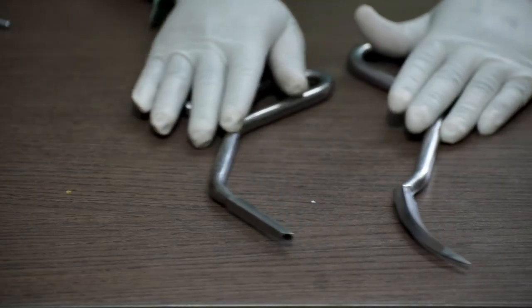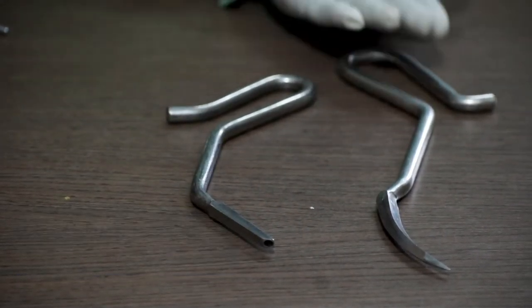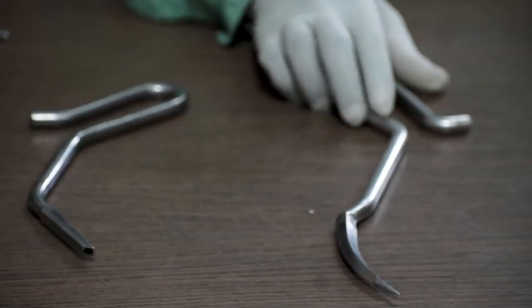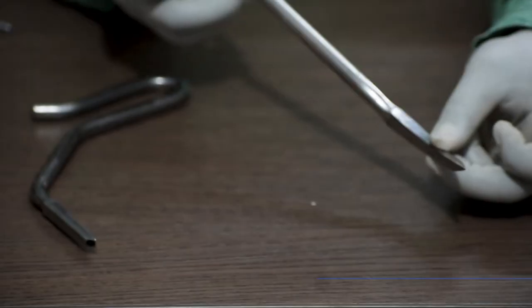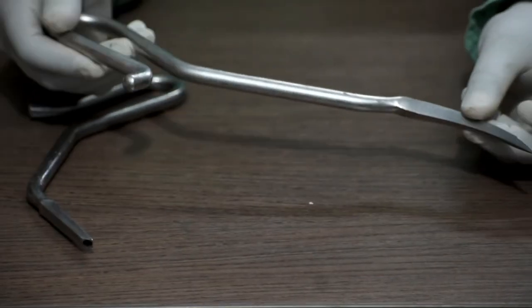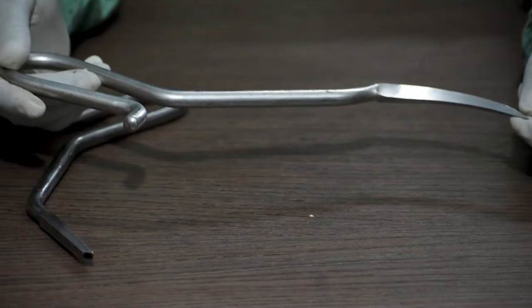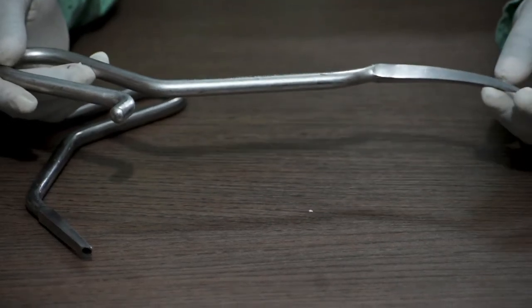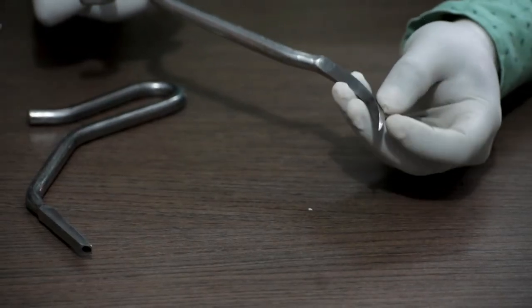Up next is awl. This one is a solid curved awl. As you can see this curvature. It has a diamond pointed tip used to create the entry point for the nail.